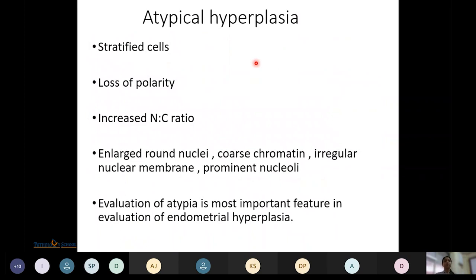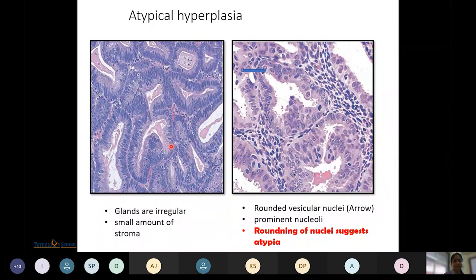In atypical hyperplasia, cells are stratified with loss of polarity, increased N:C ratio, enlarged round nuclei, coarse chromatin, irregular nuclear membrane, and prominent nucleoli. Evaluation of atypia is the most important feature in endometrial hyperplasia. Microscopically, atypical hyperplasia shows irregular glands with a small amount of stroma, round vesicular nuclei with prominent nucleoli; rounding of nuclei suggests atypia.